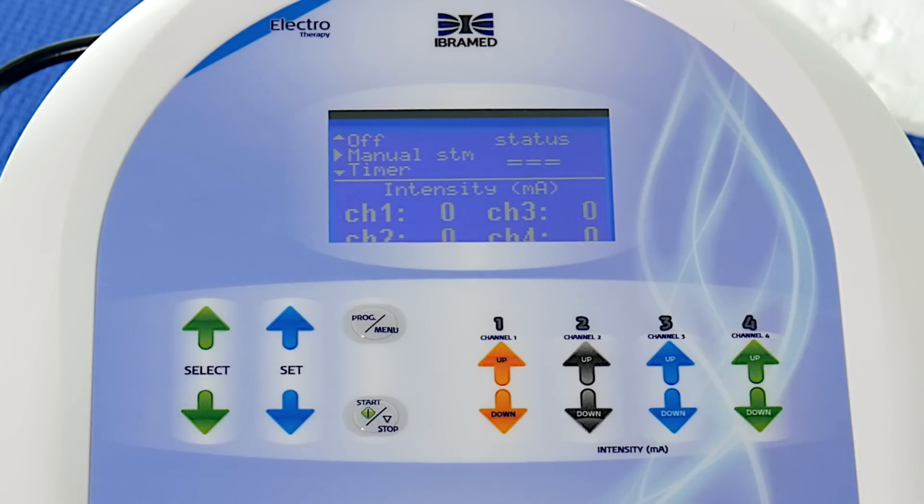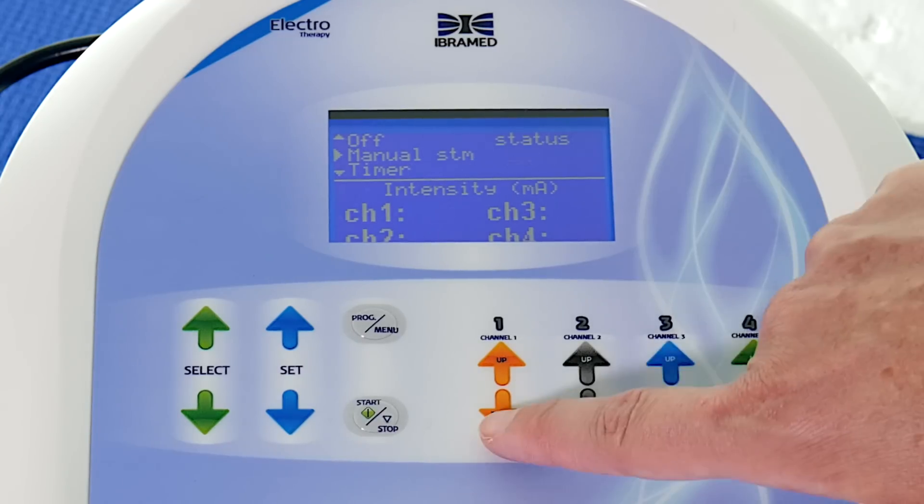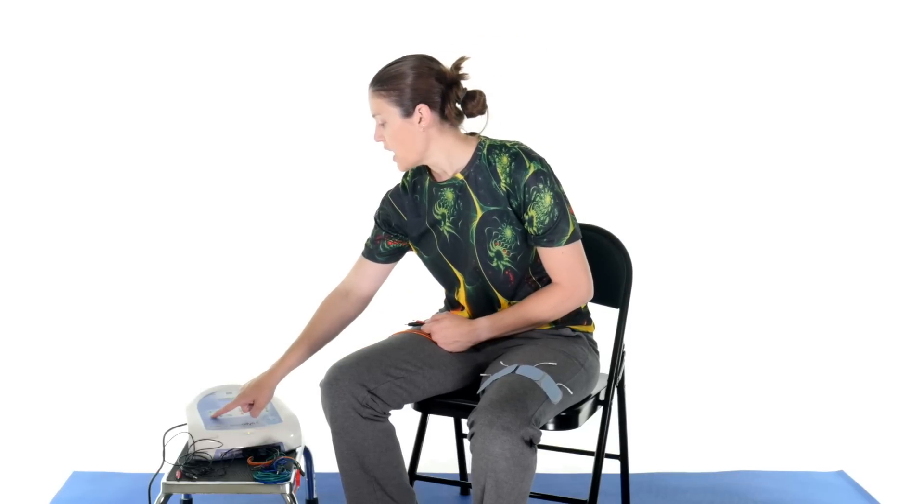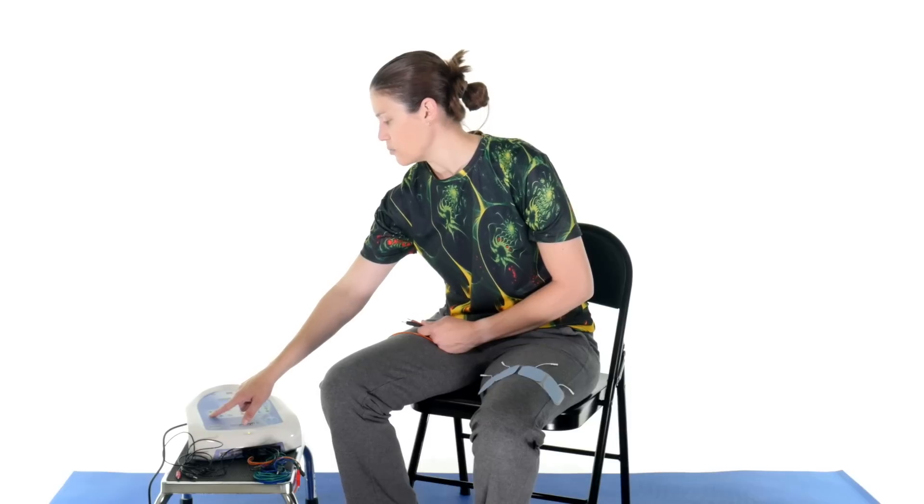It also has manual stimulation where, for example, you can use Channel 1 for TENS and Channel 2 for TENS crossing it, and independently increase the intensity between the two. That's nice because you might want the electrode on the inside a little stronger than the outside. For the Russian current, you can also ramp up and ramp down. That's important — if you've ever had it on you, you want a little ramp-up so you know it's starting. I always tell patients to tell me when it's high enough to be almost intolerable, and then usually go up one or two more, which is tough but gets that strong contraction. You can do the same ramping it back down as well.